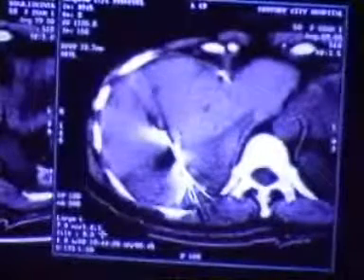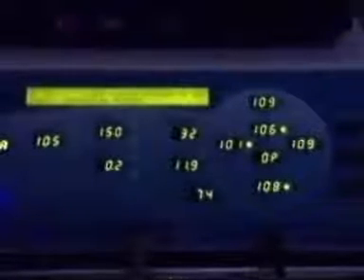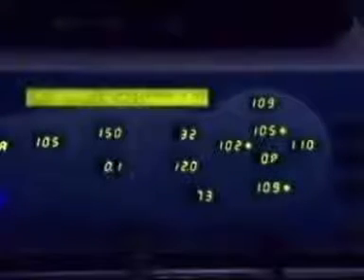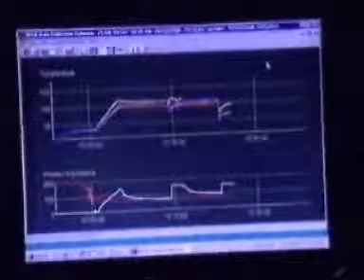Once the device is placed and the electrode array is deployed and anchored within the tissue, the ablation can be started. To do this, turn on the RF power by depressing the RF on-off button. Observe as the temperatures increase. Once the target temperature is achieved, the generator will automatically adjust the power to maintain that temperature for the length of time you set. Refer to the instructions included with the generator for appropriate target temperatures and times for each ablation.